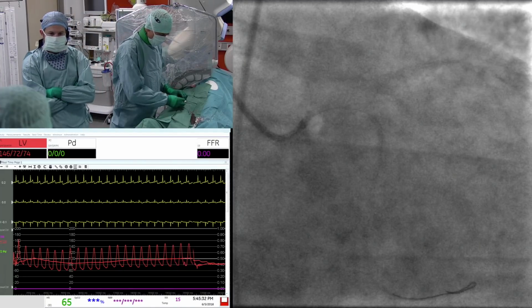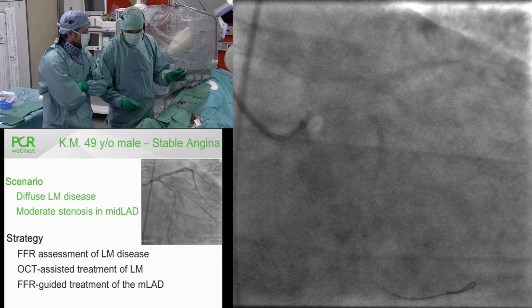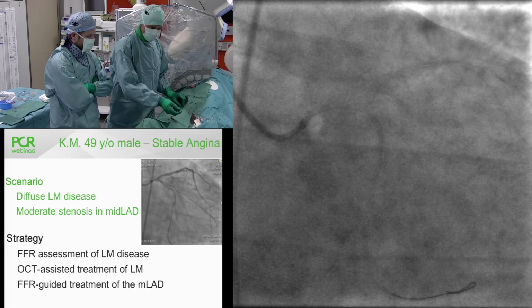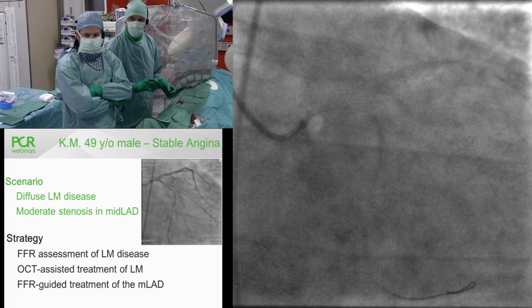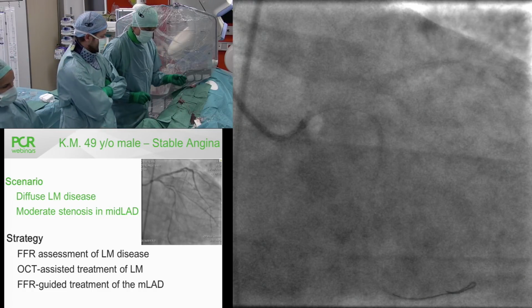While waiting for the stent, Bernard, can a self-expanding stent also be an option in this case, Bernard and Gabor? The self-dilating, self-expanding stent, yeah. I have no experience in the left main with these kinds of stents.